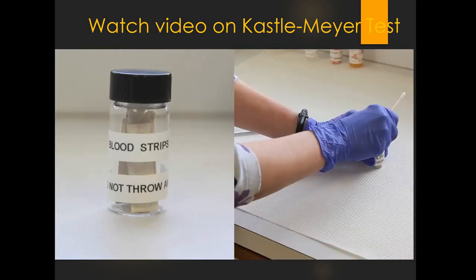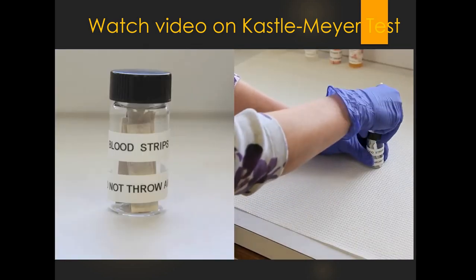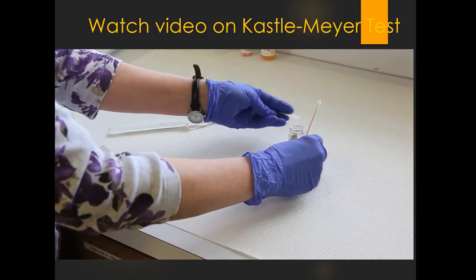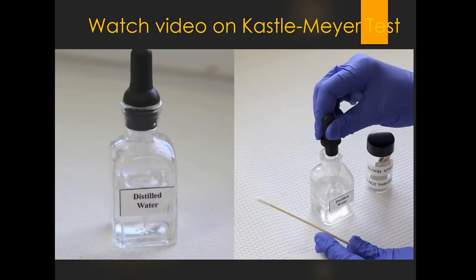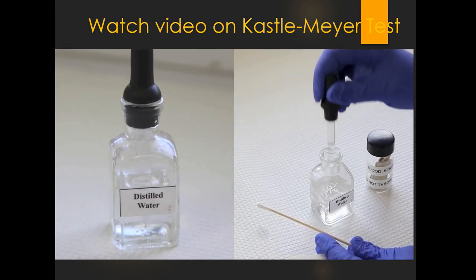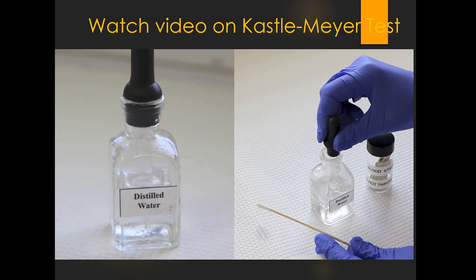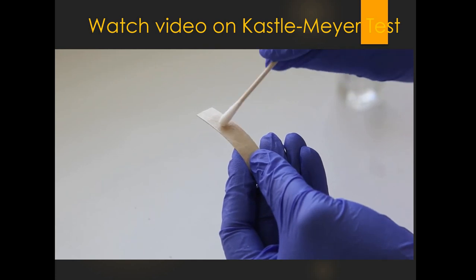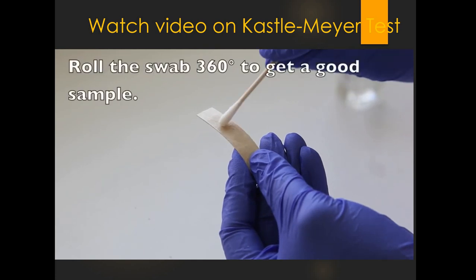Retrieve a dried blood strip from the glass jar. Add a drop of distilled water to the cotton swab. Make sure that the swab is wet all the way around so that you can pick up a good sample. If necessary, add a second drop of water. Roll the moist swab lightly over the blood strip.